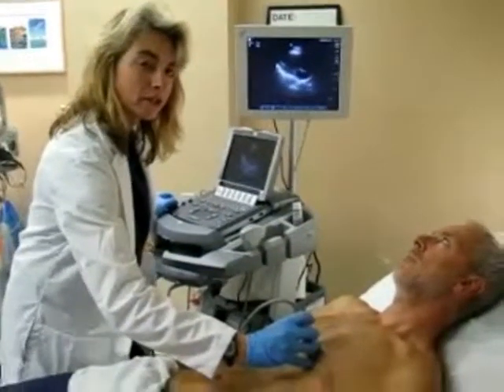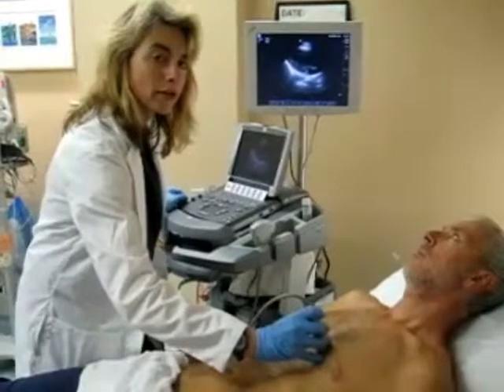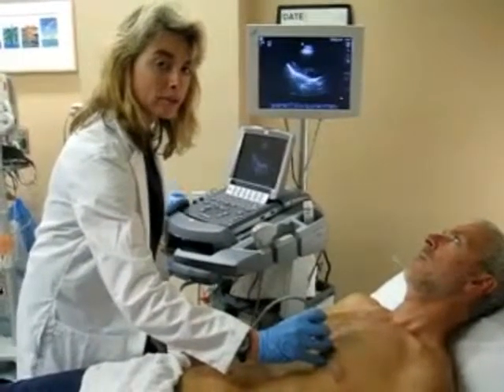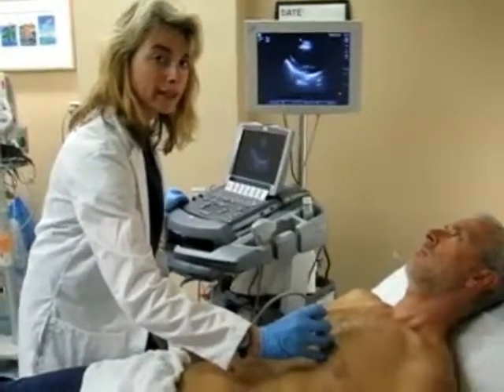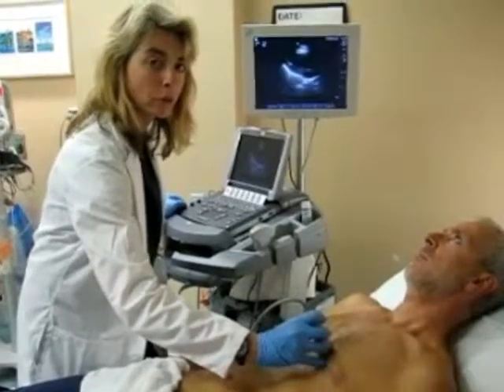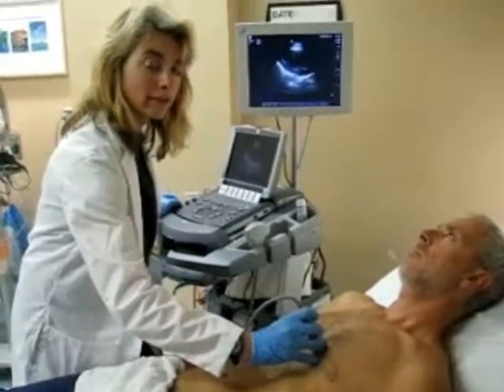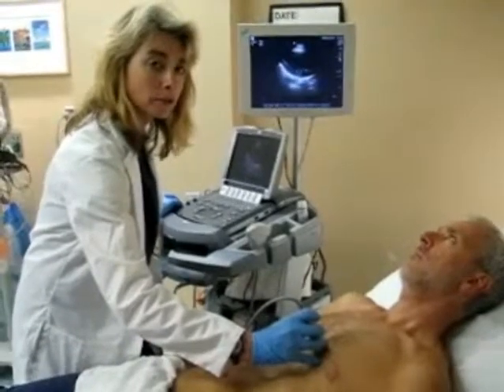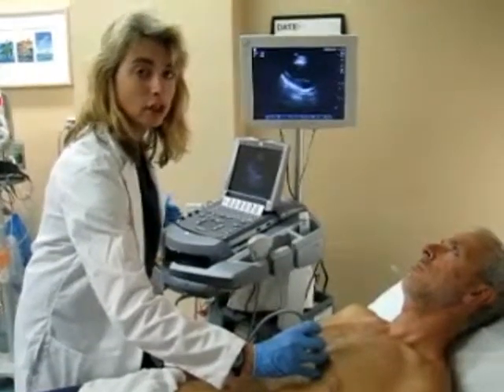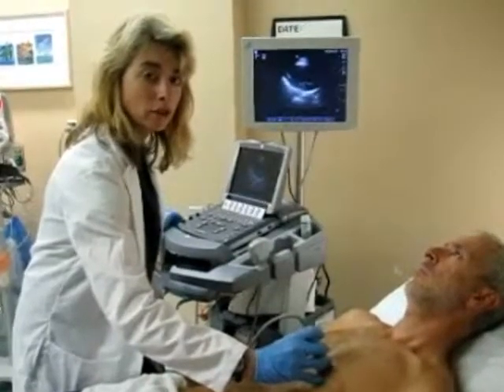In some patients it is impossible to get a good view of the heart using the subcostal view. This can be secondary to either patient habitus or pain over the abdomen and inability to tolerate the pressure of the probe. In those patients, another window needs to be evaluated, and the most commonly used is the parasternal long axis view, which is essentially looking through the chest wall to take a look at the heart.